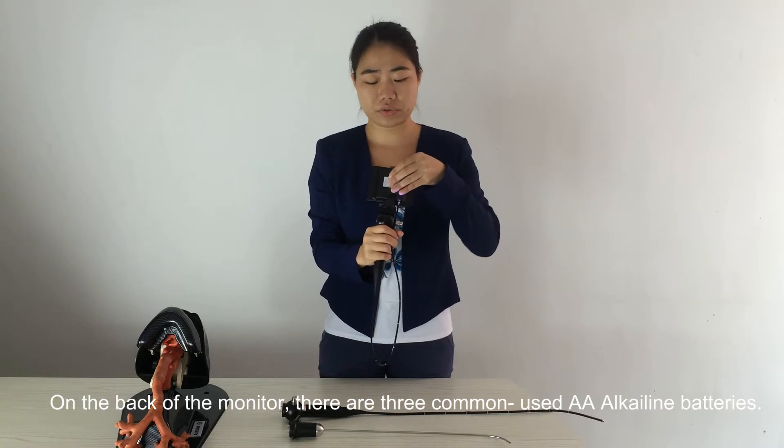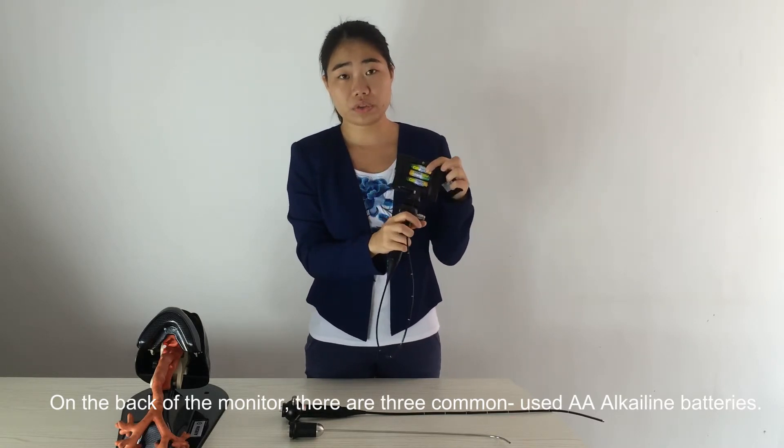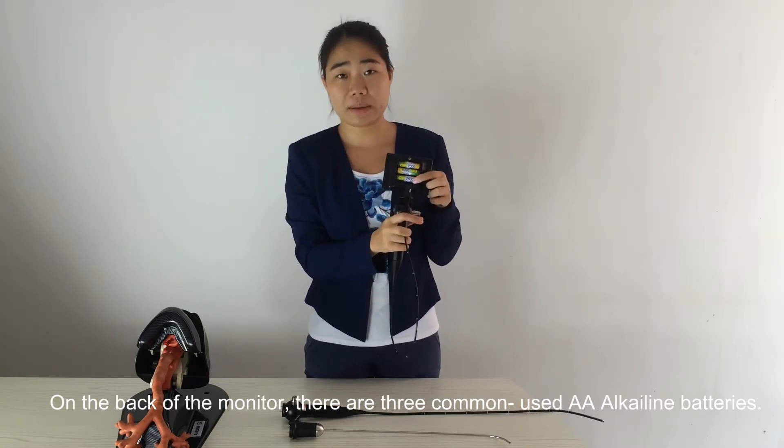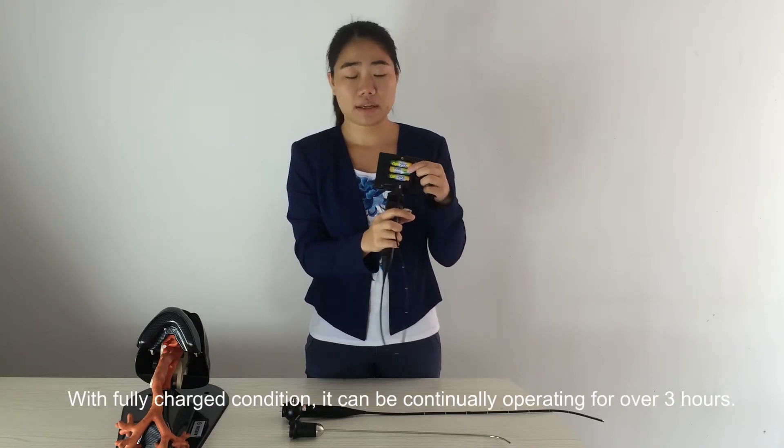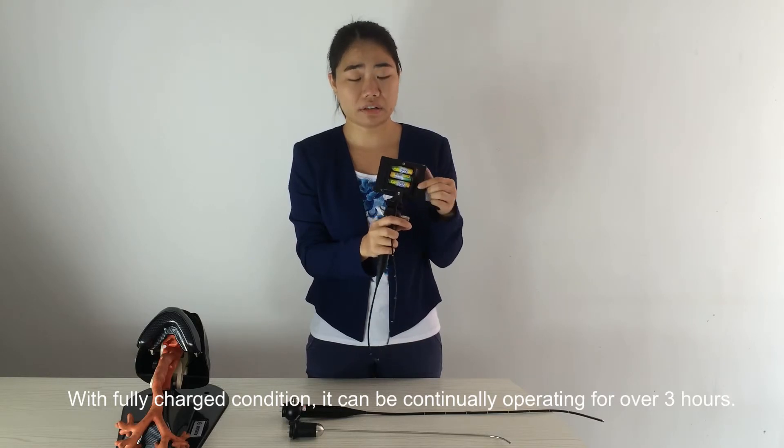On the back of the monitor, there are 3 common AA alkaline batteries. With a full charge, it can operate continuously for over 3 hours.